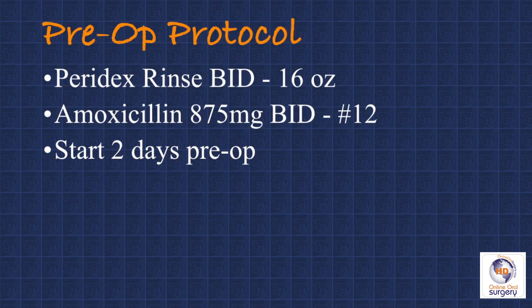I'm going to start the patient on my standard preoperative regimen, which is Peridex rinse twice per day and amoxicillin 875 milligrams twice per day, both started 2 days before.